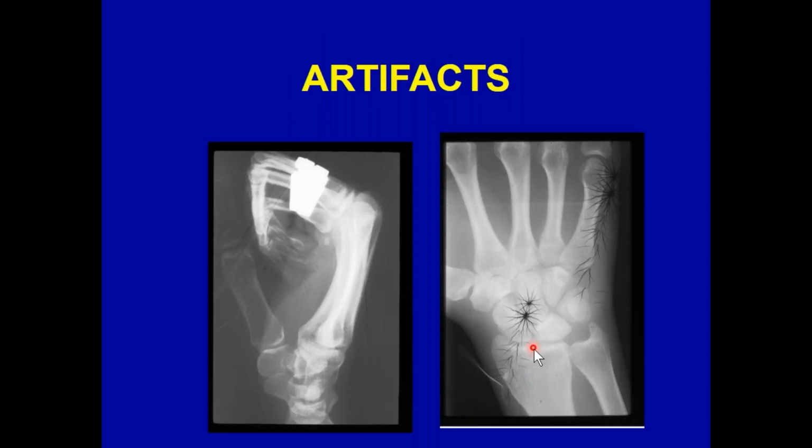Having said that, we have all these wonderful tools available to us. We've shown you how to take a good X-ray, and I guess I should add, at this point, if you collimate to the area of interest and put your radiographic marker on, we would avoid all the issues with what we started the recertification class with.